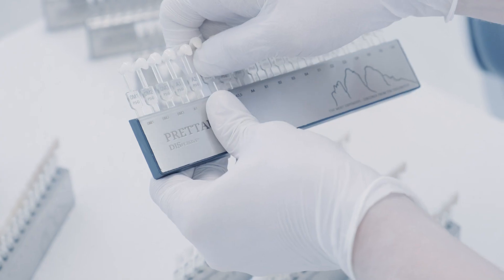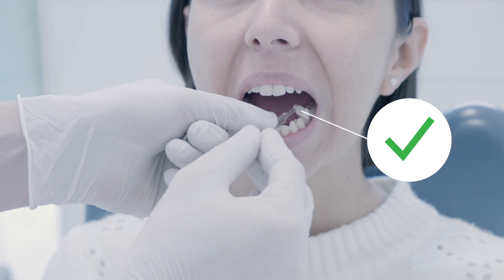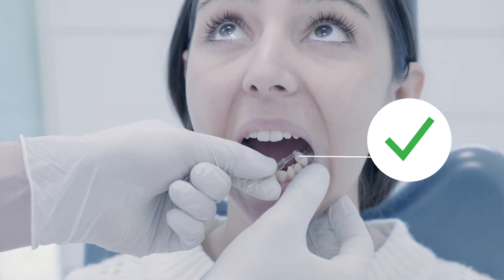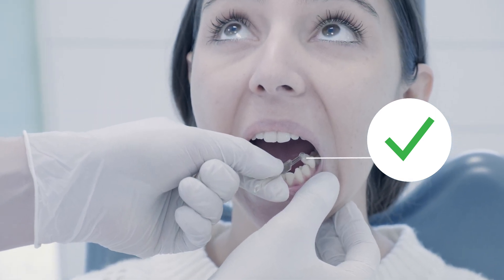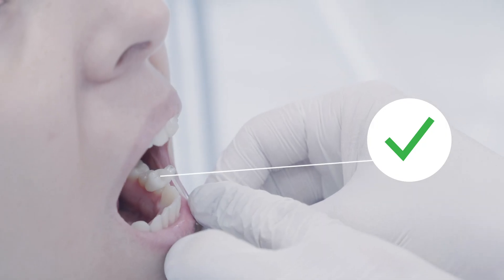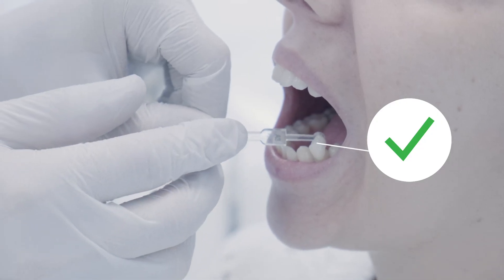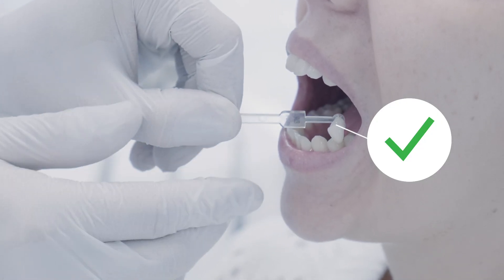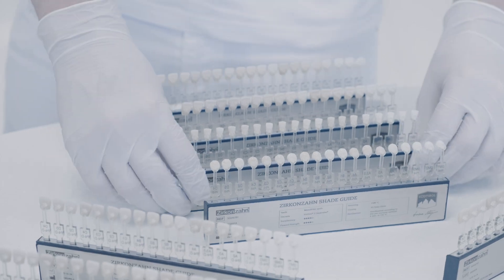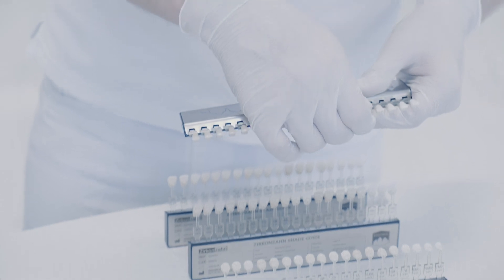Hold the shade guide in the shape of a premolar against the natural teeth to determine the natural tooth shade in the posterior region and the shade effect on the occlusal surfaces.